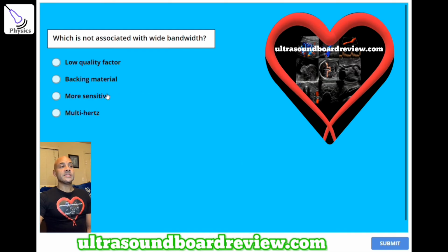The answer is C. More sensitive. When you have a wide bandwidth, that means it's going to be less sensitive to convert low-level frequency Doppler shifts into meaningful electrical signals.